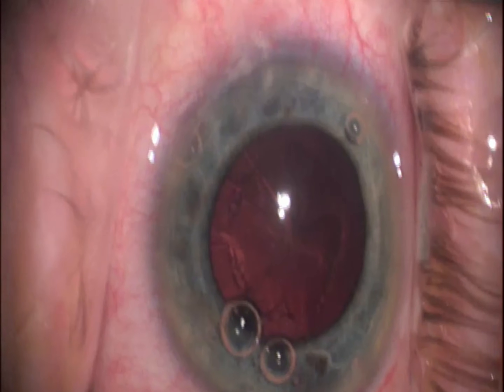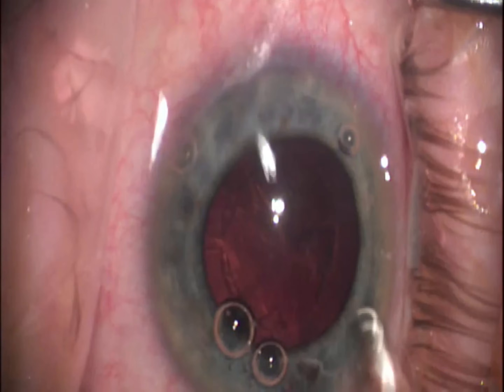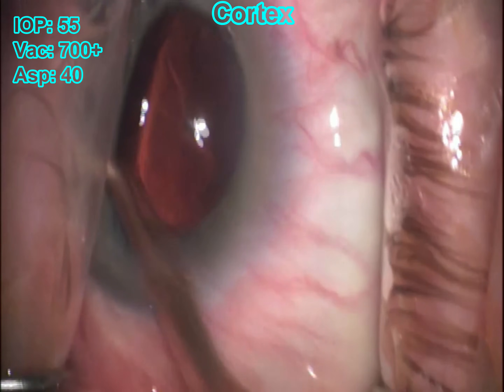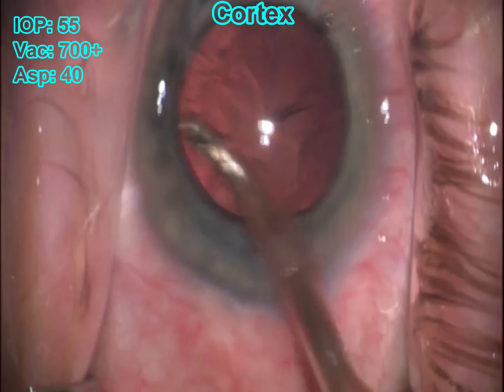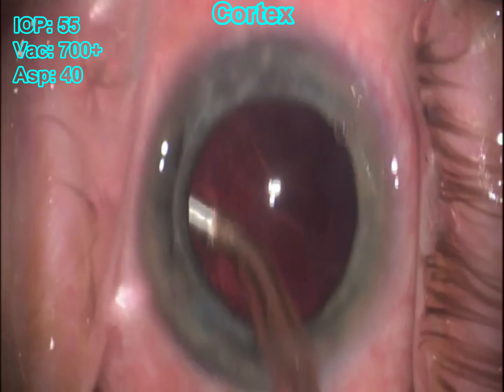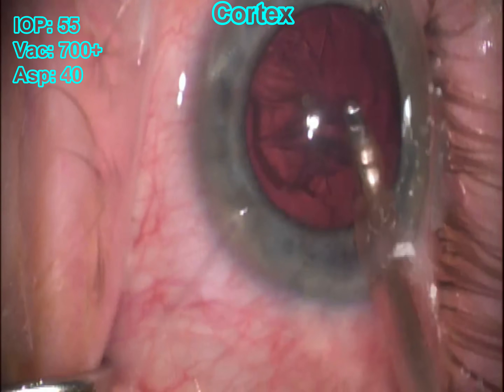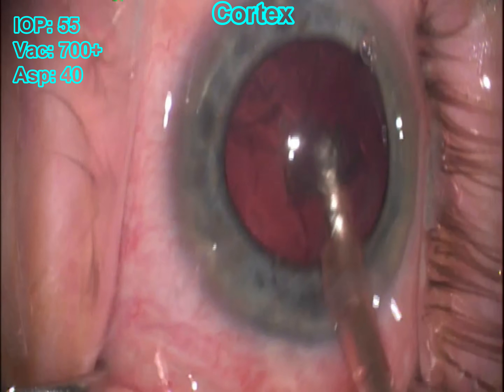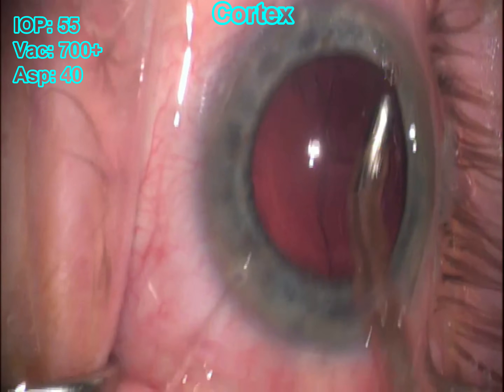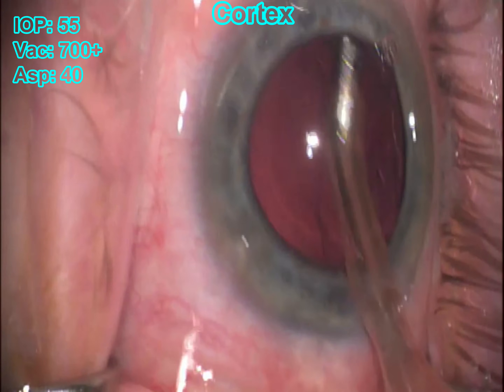We're getting the IA handpiece set up to chase all that cortical material. I like to start laterally and then work my way around, finishing with the subincisional area last. I find that if you loosen up everything else first, it makes that subincisional cortex a whole lot easier to remove. Sometimes, though, independent of what you do, the cortex can just be extremely sticky — it just doesn't want to come off. This is one of those cases where that subincisional or lateral leftover cortex becomes kind of a pain because it just doesn't want to release.